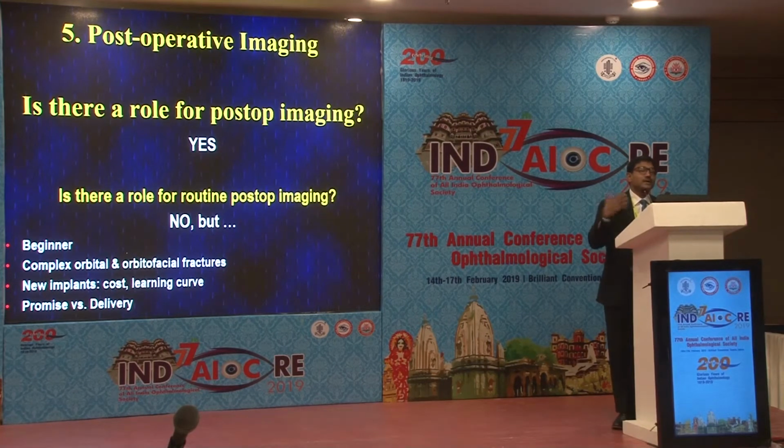Okay? And if you're starting to use new implants, because you're going through a learning curve itself, I think you need to know whether the angles that you bent are sticking in, whether you placed it on the posterior ledge is really on the posterior ledge, believe it or not. Even with navigation, I've seen implants being stuck below the posterior ledge rather than above the posterior ledge. So technology is not a replacement technique itself.